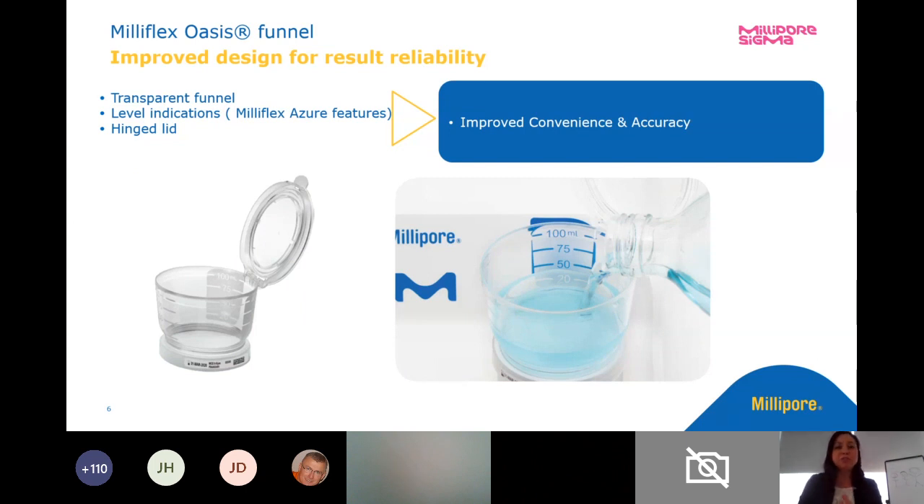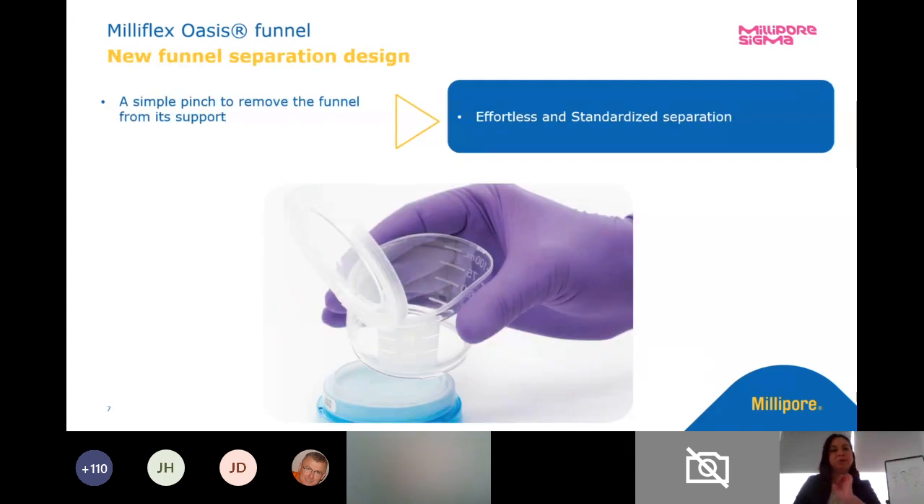We also improved the Milliflex Oasis Funnel. We looked at our previous funnel to design the Milliflex Oasis Funnel. We changed the transparency of the funnel materials, so now you can see through the funnel material to see what you're actually filtering. We added the level indications and also incorporated a hinged lid. We'll get into why that's convenient in a little bit too.